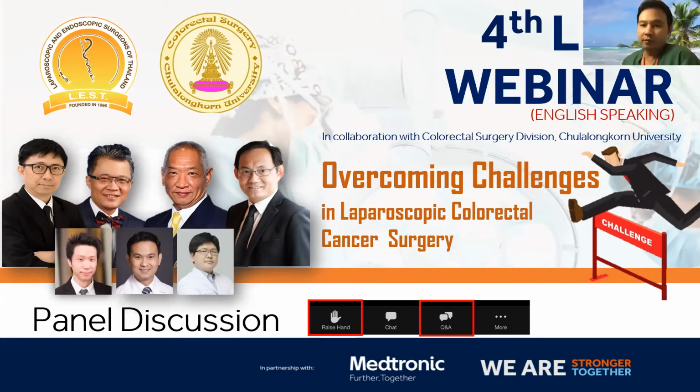to do the multi-visceral resection, like do excentrations or like this case, the previous case that I showed you today, the T4 lesion for the right side. And in those particular cases, they have very dense desmoplastic reactions, and sometimes the surgery takes very long.